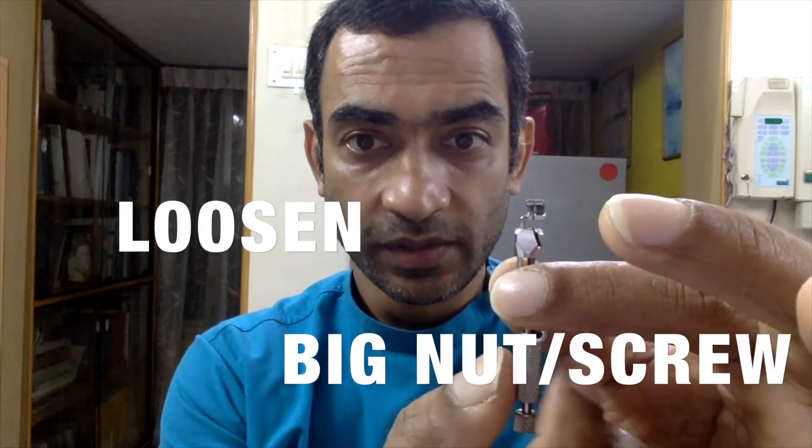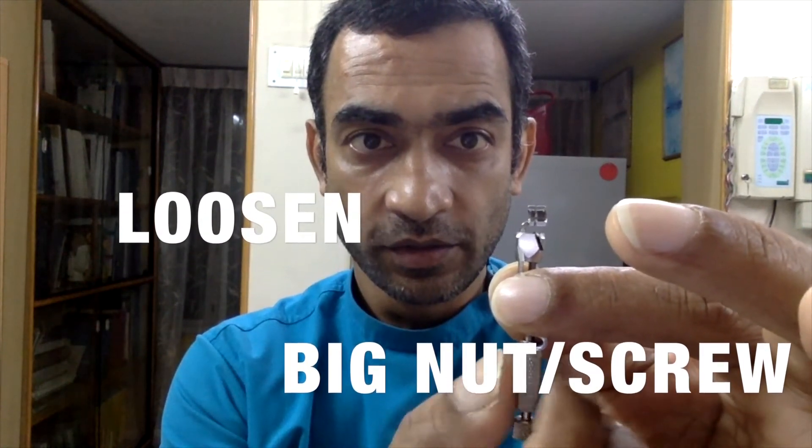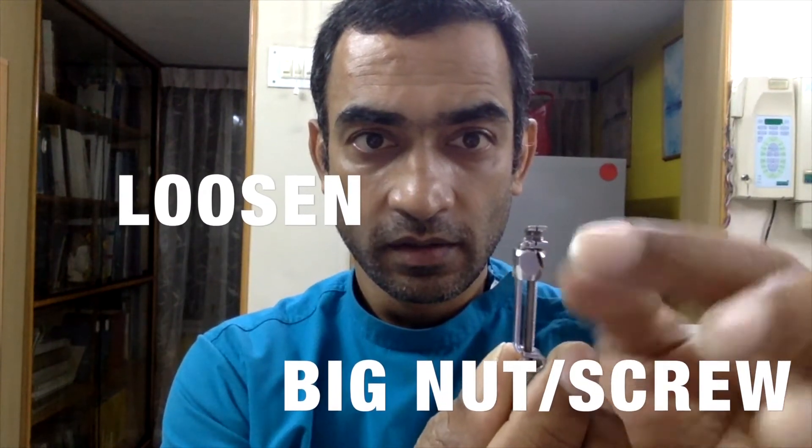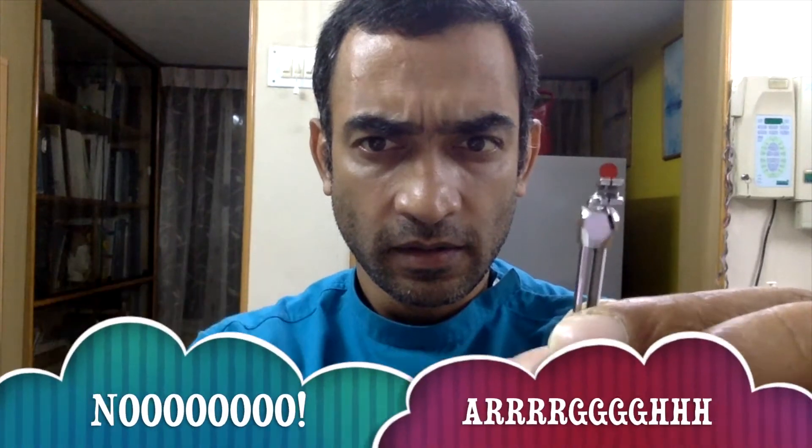Step one: loosen the big screw so that this little rectangular piece moves up and jams against the top. Tightening it and loosening it controls that position.